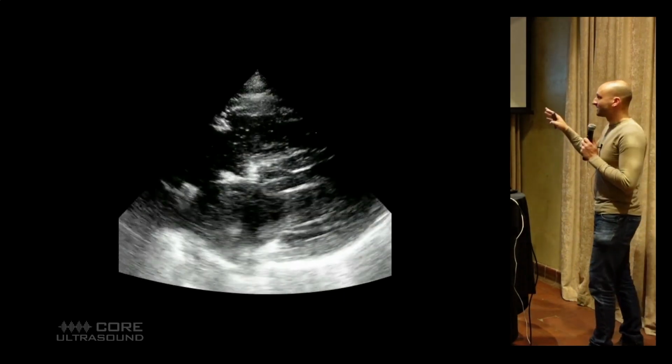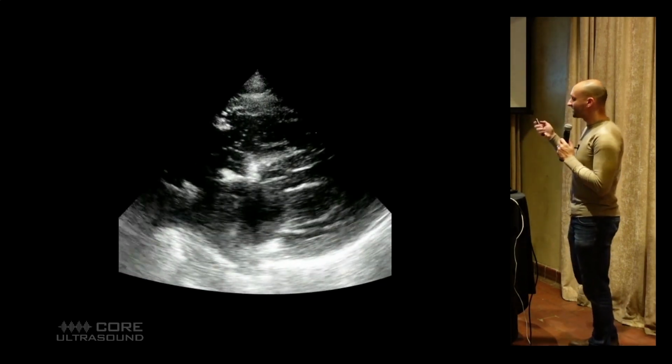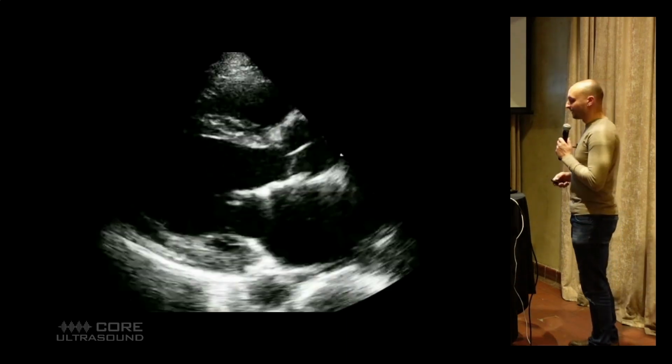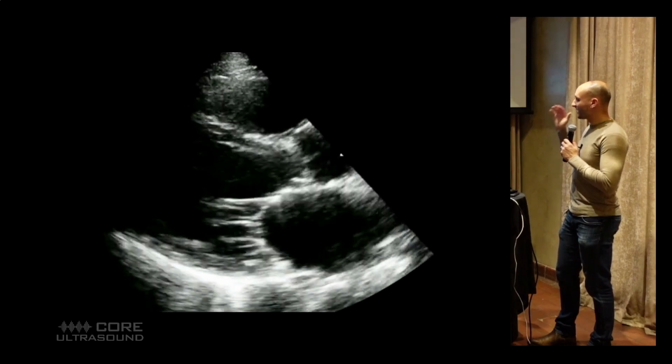Honestly, if I saw this, it would still be so low, I would still say that there's no pulse, right? But this is a complete cardiac standstill, and this is something that can happen with the BVM. This is a good example. This is actually a post-arrest echo that I had.